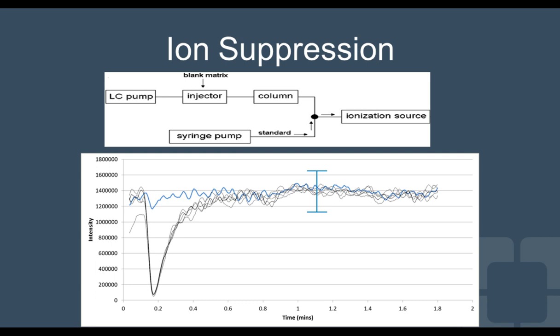The first experiment is ion suppression. Ion suppression is a phenomenon with LC mass spec methods. In a perfect world, your analyte would be the only thing eluting from the LC column and being introduced into the ion source. Unfortunately, this is a foregone impossibility. There will be many other analytes, even if they're not direct interference, eluting at the same time from the liquid chromatograph. If they're in high enough abundance, they can compete for the ionization of your analyte of interest, or leaving the liquid phase, entering the gas phase and ion, and being introduced in the Q1.